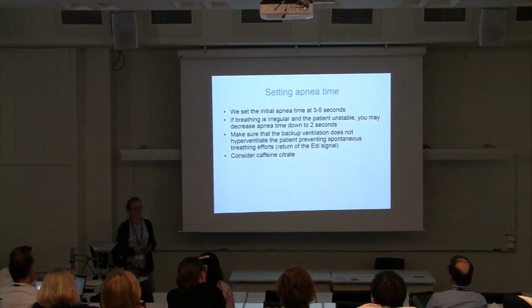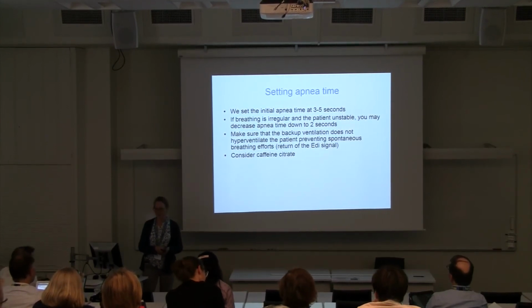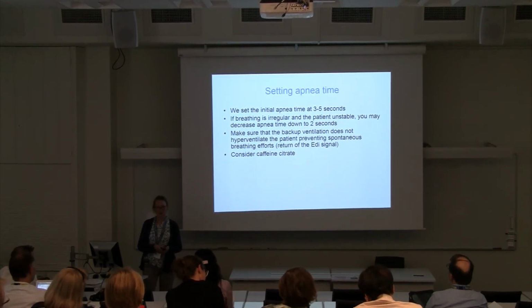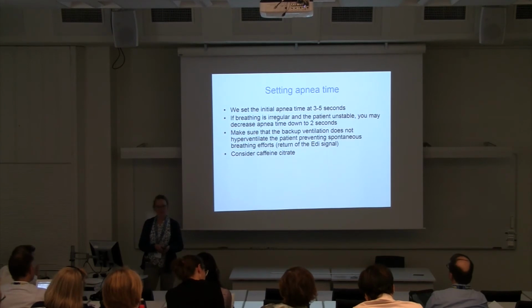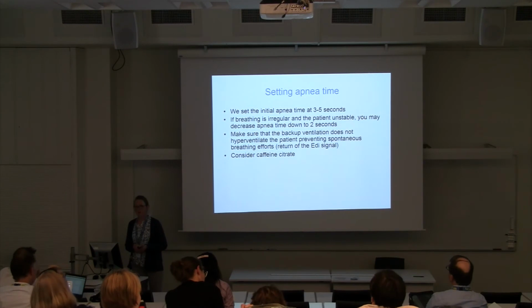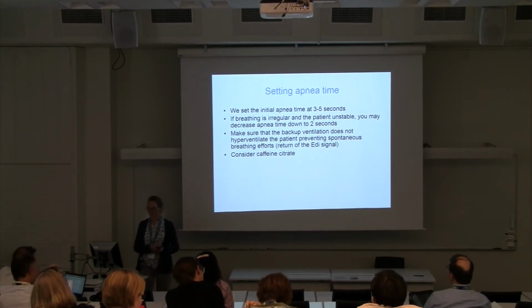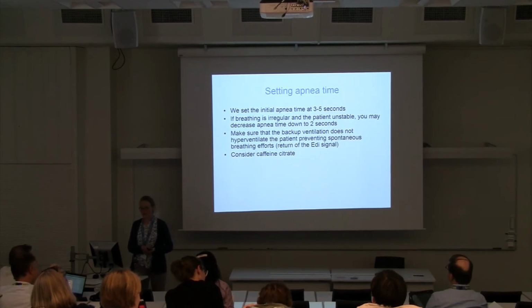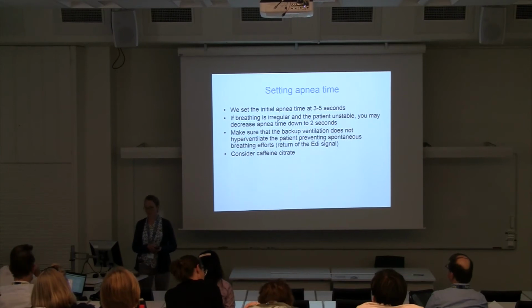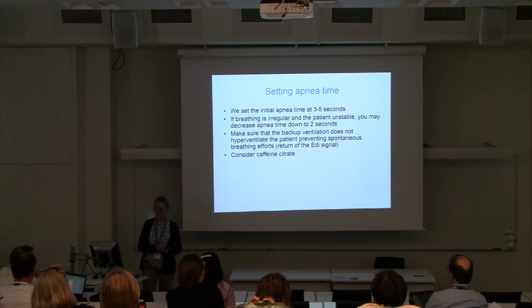So we can also set the time after which the ventilator is switched to backup ventilation. It is called the apnea time, and we set it initially from 3 to 5 seconds. But if the patient is very unstable, then we go down to 2 seconds. And then we have to make sure that the backup ventilation doesn't hyperventilate the baby, and we almost always put the baby on caffeine.